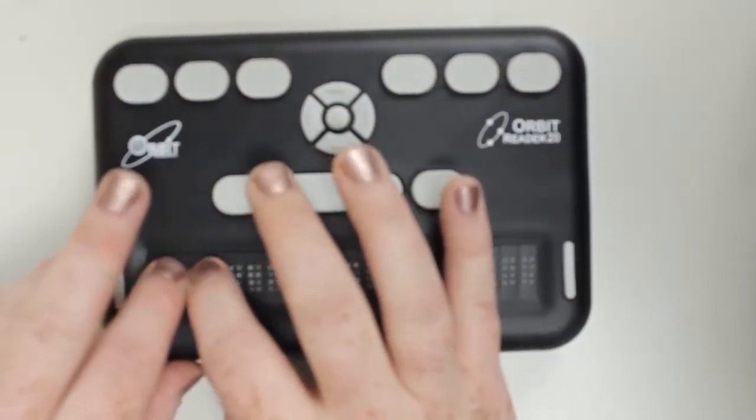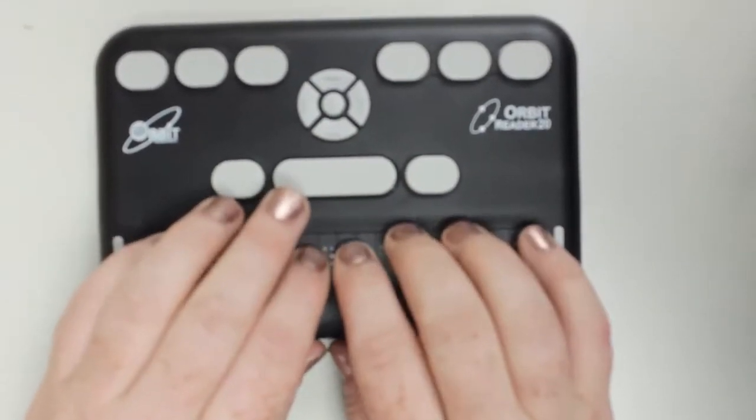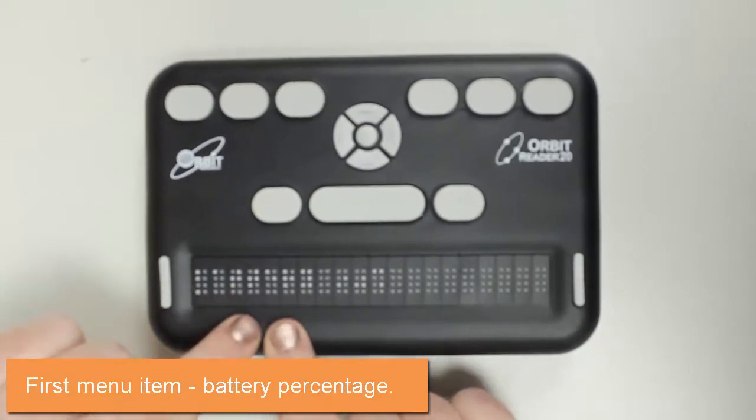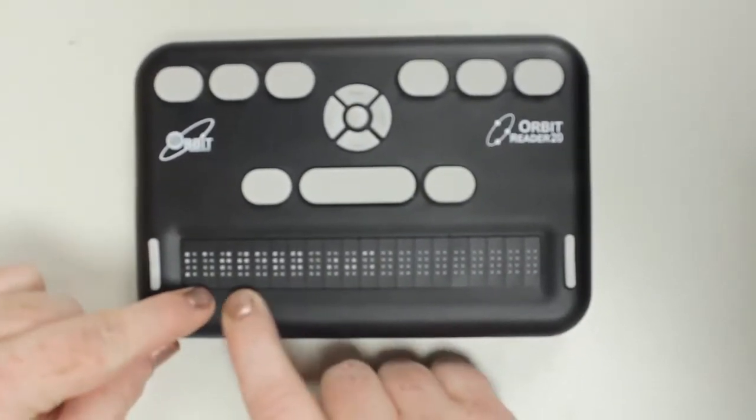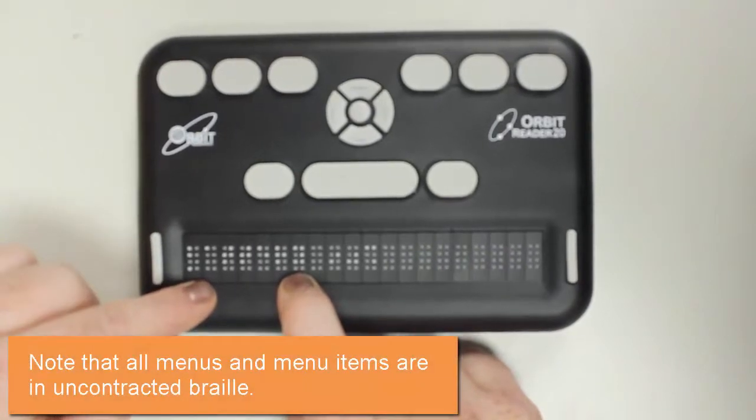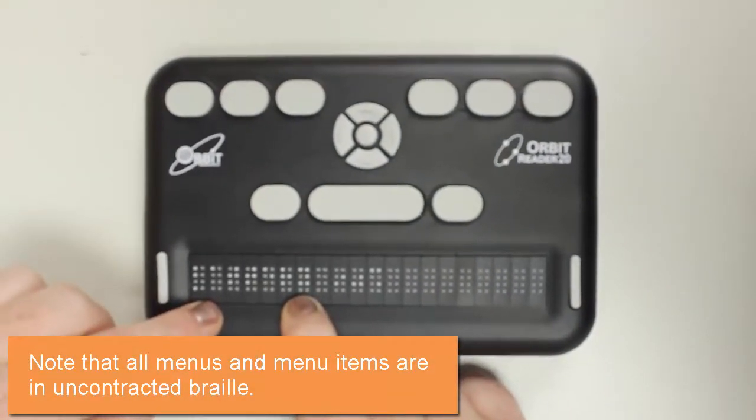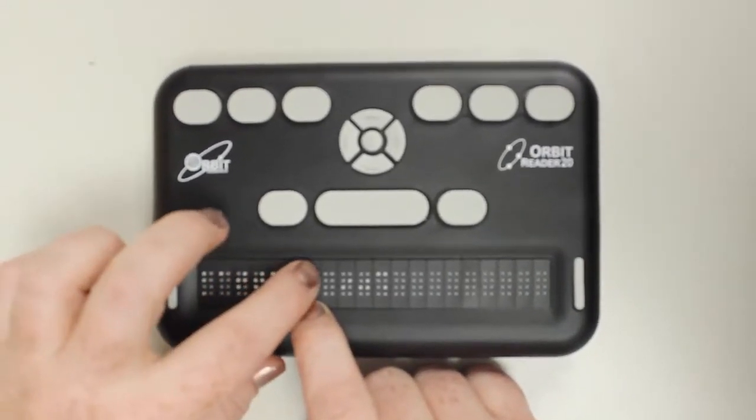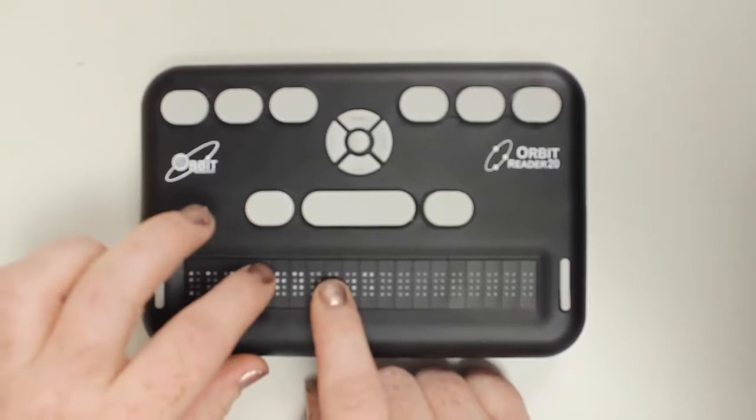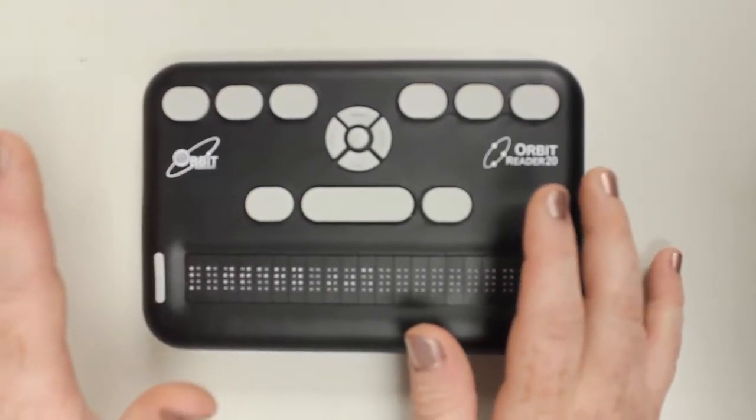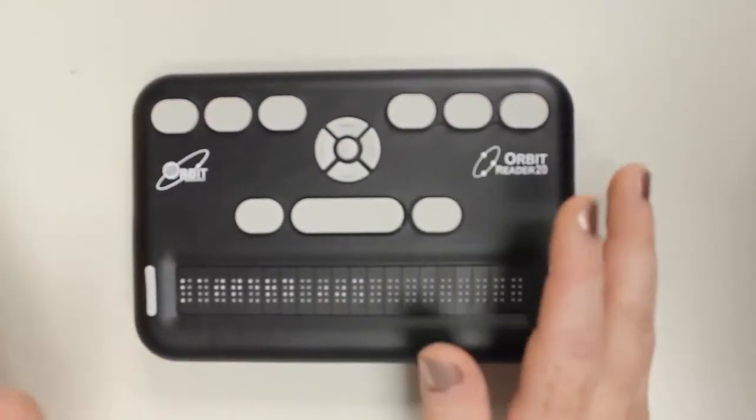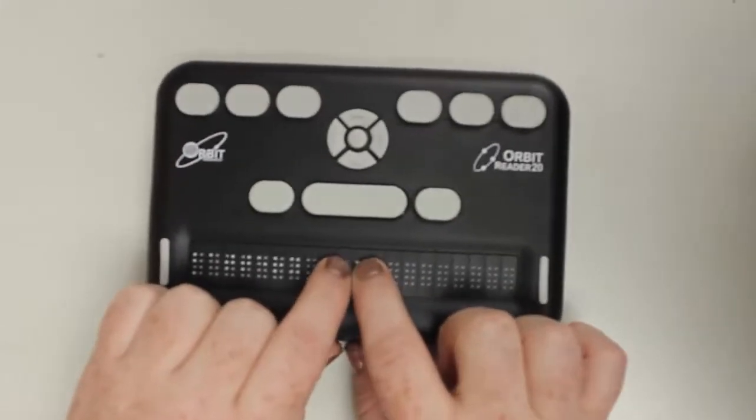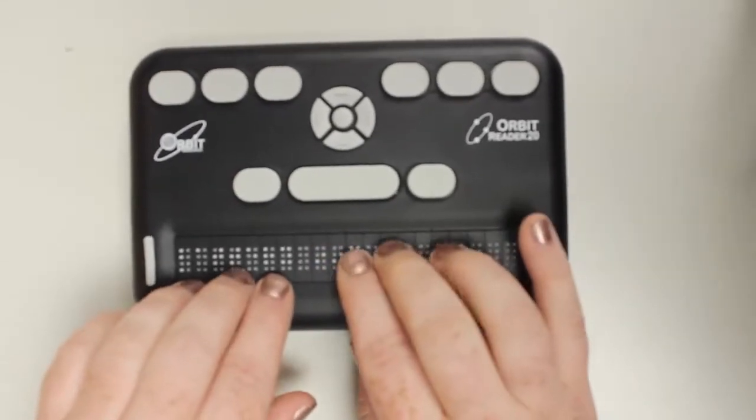The first thing that's on here is the battery level. Right now, my battery is at 90%. This is completely uncontracted braille, and remember that's because there's no translation. So if your students get mad that it's in uncontracted braille, that's why you can explain that to them. The first thing that comes up is the battery level, which is nice because that's the first thing most of us want to know about.